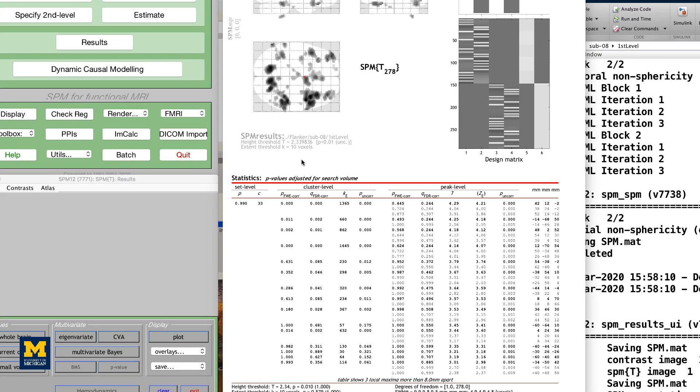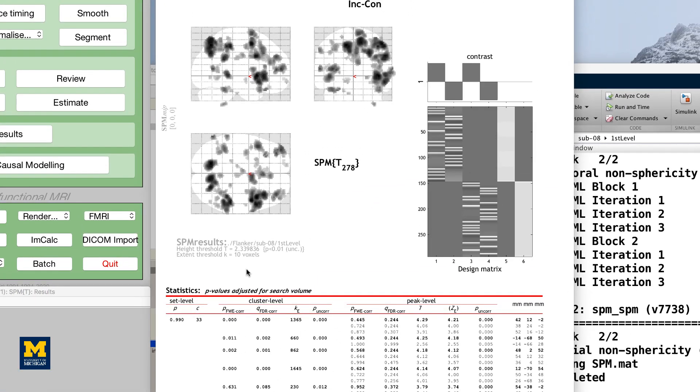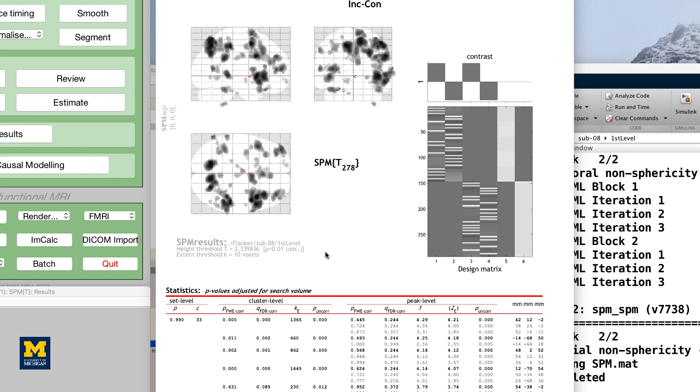When you have finished specifying the options, you will see your results displayed on a glass brain. This shows your results in standardized space in three orthogonal planes, with the dark spots representing clusters of voxels that passed your statistical threshold. In the top right corner is a copy of your design matrix and the contrast you are currently looking at, and at the bottom is a table listing the coordinates and statistical significance of each cluster.